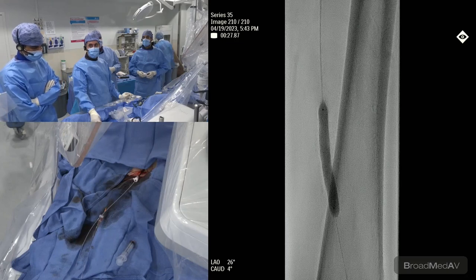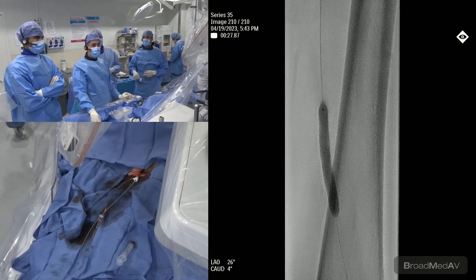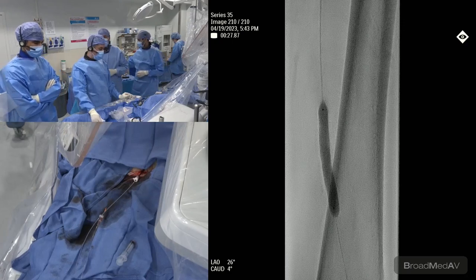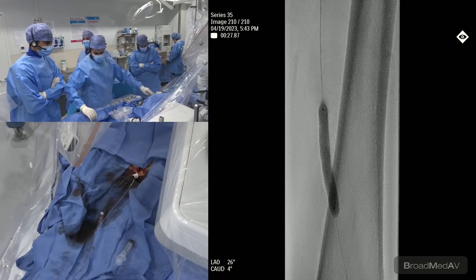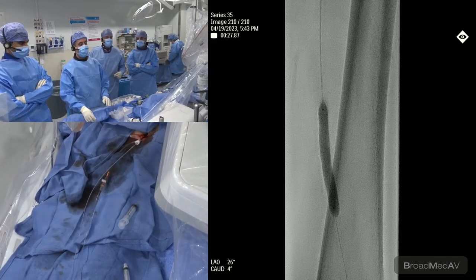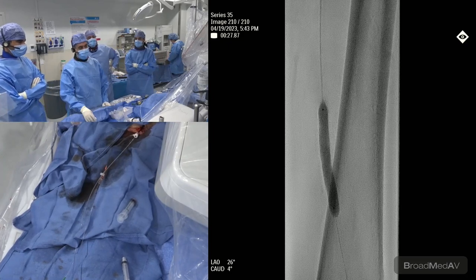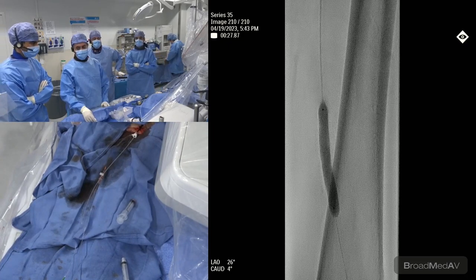60? No, it's 6.5. You don't have 6.0. 6.5 is going to be longer. 6.5 is too long. Okay. So again, as you know, we're challenged with different sorts of things. Real life challenges, real life problems, even here at Sinai. What do you have now? It's a long 6.0 by 80. That's fine. Give us a 6.0 by 80. Okay, we'll deal with it.